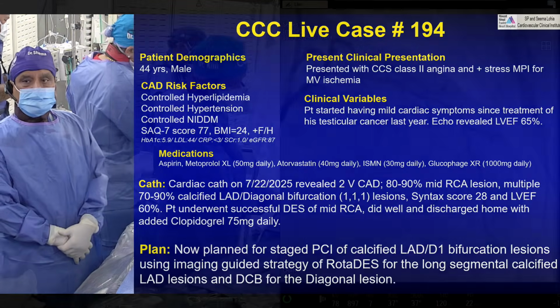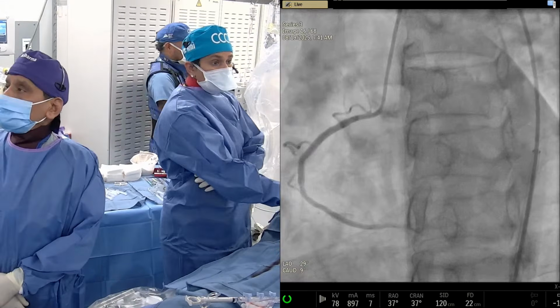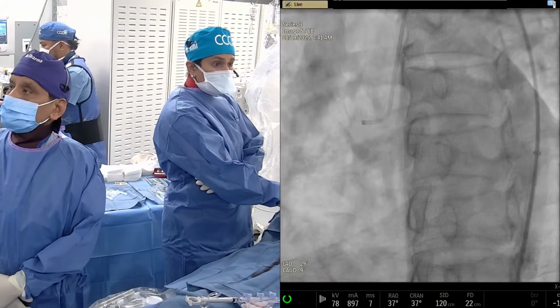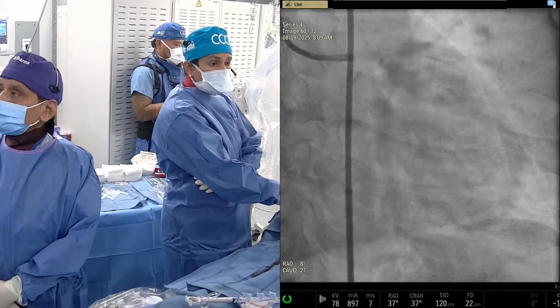Today, Anu, you want to show this now? Let's see the angiogram first. RCA, yeah. Good LV? Yeah, it's a good LV function. Normal. EDP was normal. This is where we are for the left system. Circ is okay.